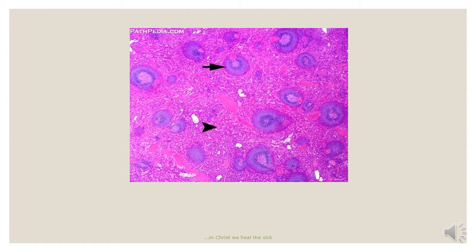We move to the slide of the spleen. The spleen is a lymphoid organ made up of red pulp and white pulp. Microscopically, the spleen appears to consist of discrete white nodules called the white pulp, embedded in a red matrix called the red pulp. The white pulp consists of lymphoid aggregates, as you can see in our slide, and the red pulp makes up the background.